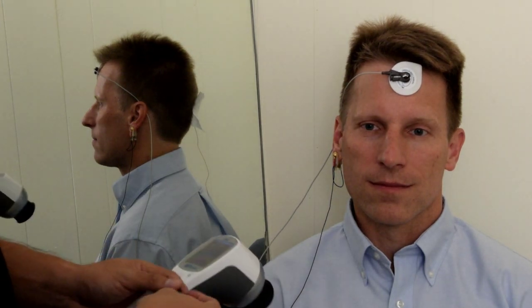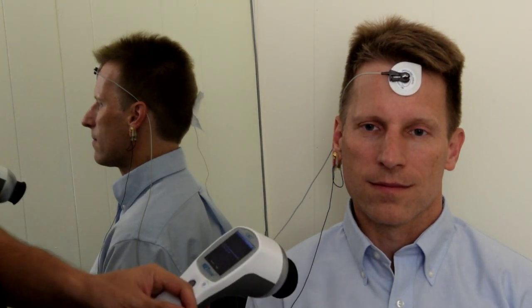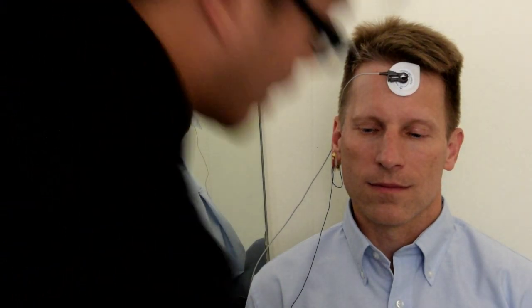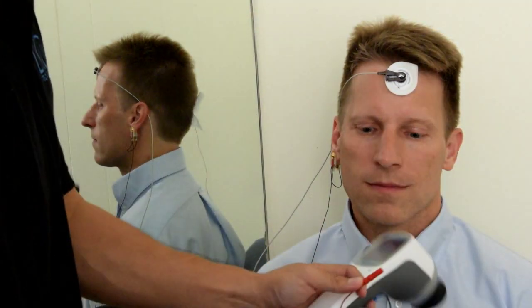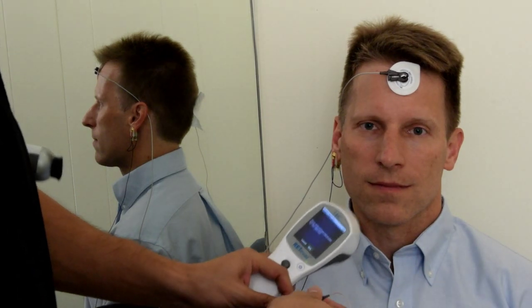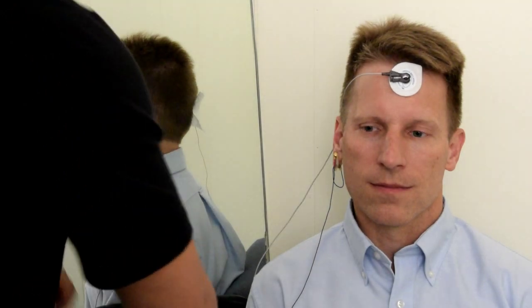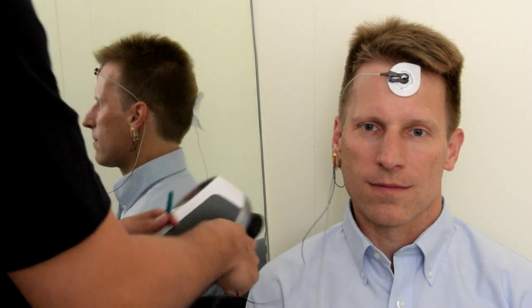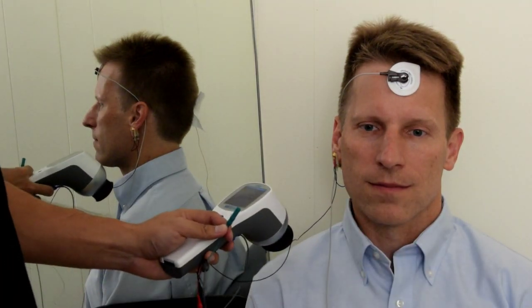After you have placed the electrodes, you want to ensure that each connection is placed on the proper wire. For the back of the head, or the recording electrode, you want to connect it to the red cable. For the forehead patch, or the reference electrode or the negative electrode, you want to place on the black cable. And finally, the ground or common electrode, or the ear clip, you want to place in the green connection.